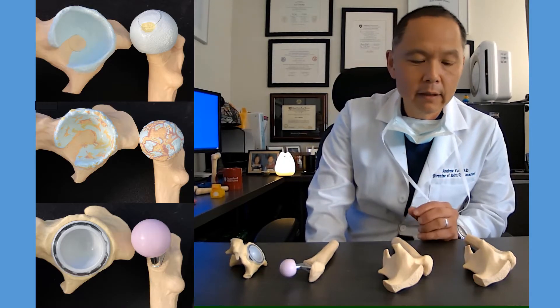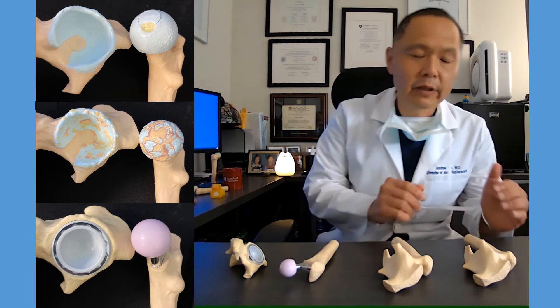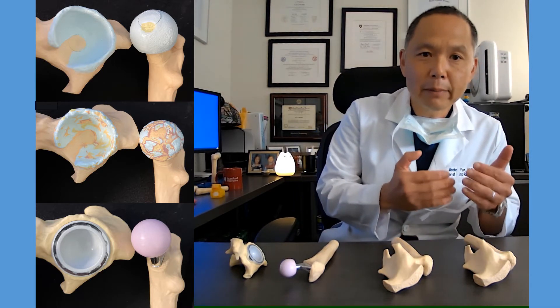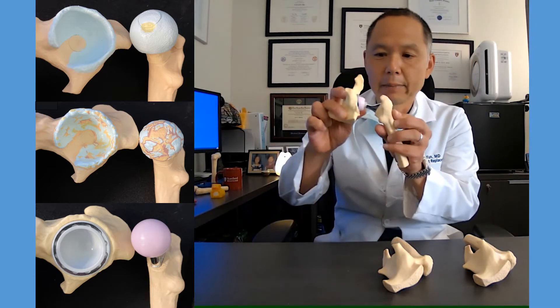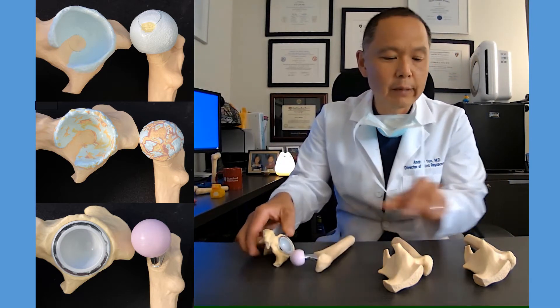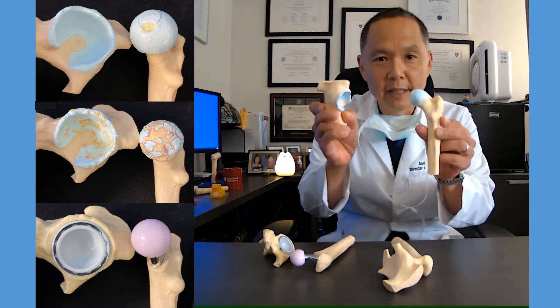Let's take a few moments and look at a very brief description of what a hip replacement looks like mechanically. But before we get to the hip replacement, we're going to talk about the organic or the native anatomy.